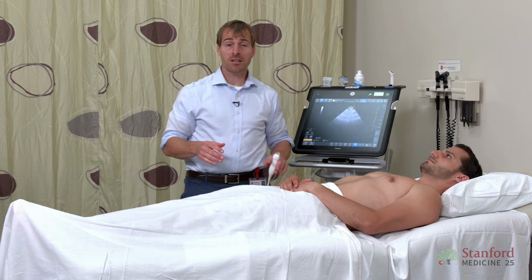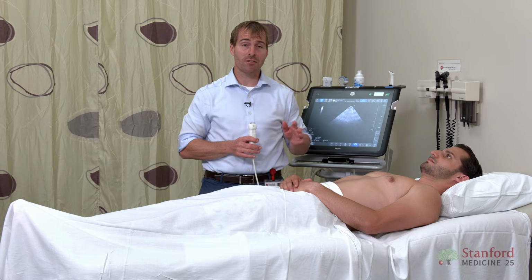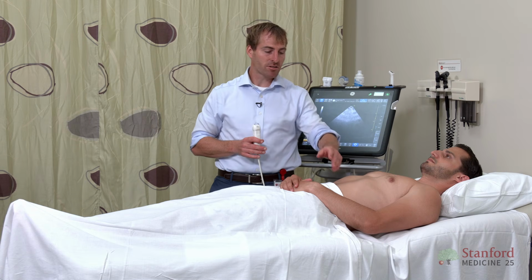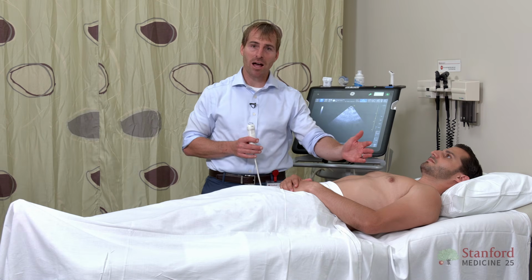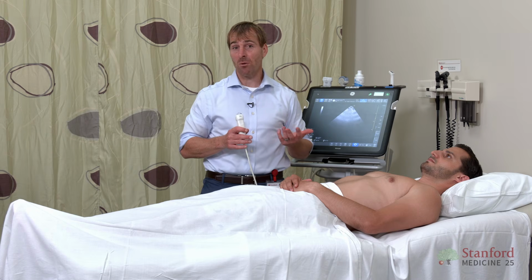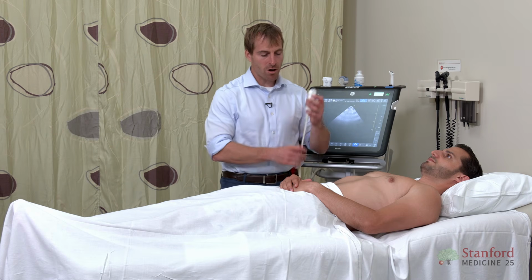So finding the IVC is easy when it's easy, but there's going to be many times where you go to look for the IVC and you just can't find it, the way we just went through it. Sometimes it's because the patient has a large stomach bubble, there's gas in the stomach and it's getting in the way. Sometimes their liver's a little bit high up under their diaphragm, or they've got a lot of gas in their transverse colon. Sometimes you honestly just don't know why you can't get the pictures you want to get, and it can be very frustrating. So let's start where we were before.